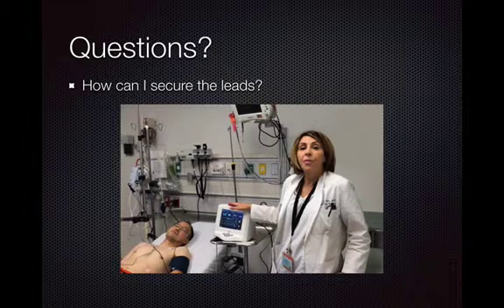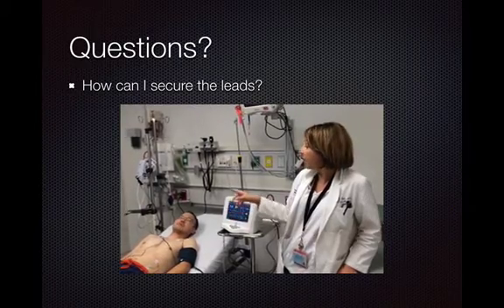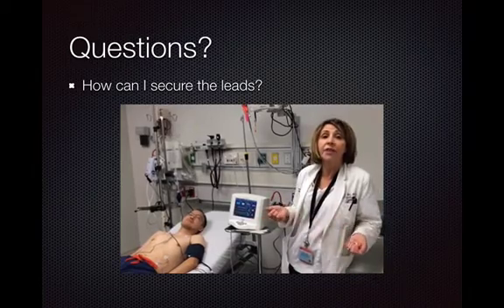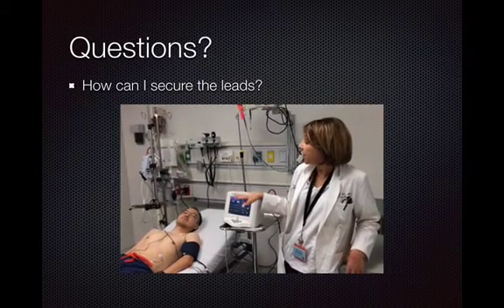The first is, what if you're afraid the leads are going to fall off? What if it's someone who's sweaty, or you've tried to shave them and they're still a little bit coarse? What can you do? I put a Tegaderm on as soon as you get a good tracing. Remember when I said don't touch them, don't move for 3 minutes? Once that 3 minutes is up, put a Tegaderm on when you know it's working just fine. You need 4 big Tegaderms to go over every lead, and that'll help hold the leads in place.